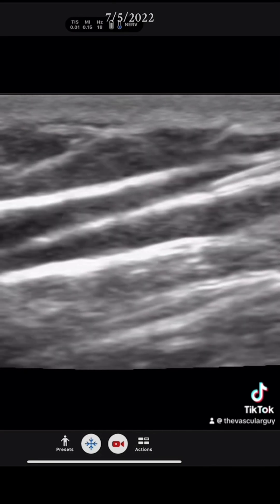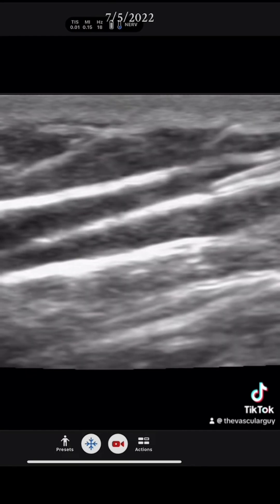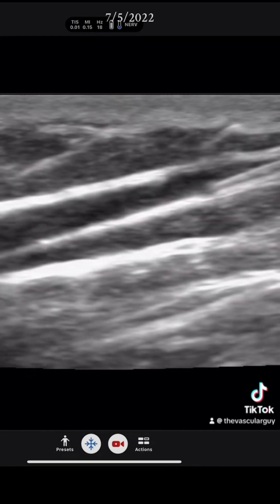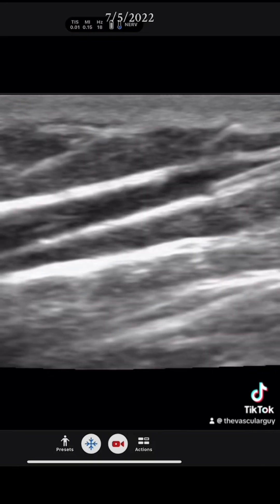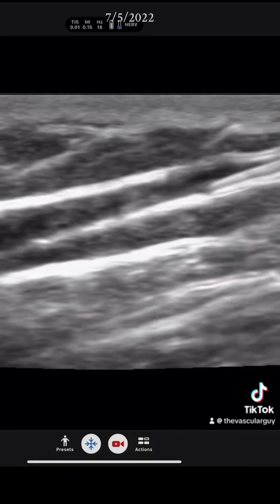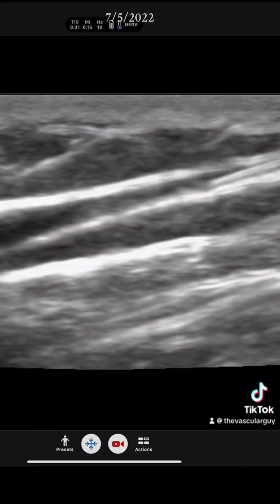Right here I'm pushing pretty hard — hard enough to collapse that vein. I'm not compressing the top and bottom tissue; it's just the vein itself collapsing because I flushed so hard that I created a vacuum. This vacuum is continually going to slap the veins together, and the shearing force of the flush also causes damage.